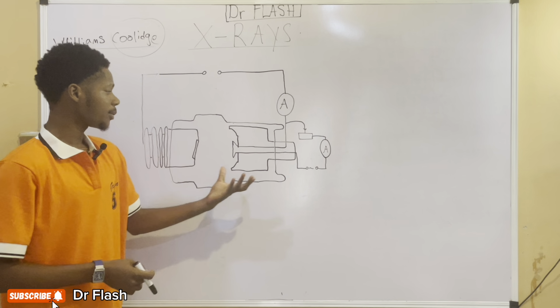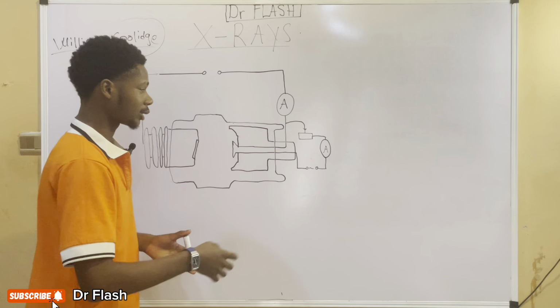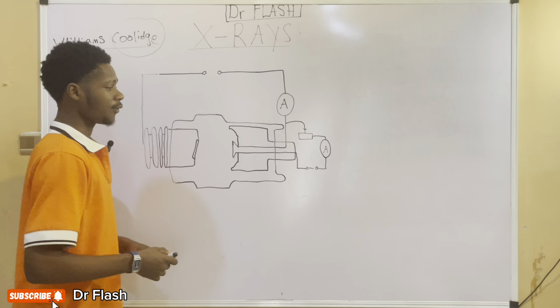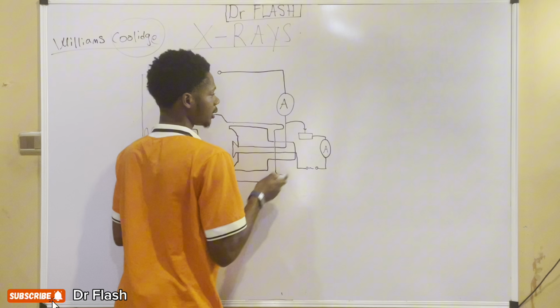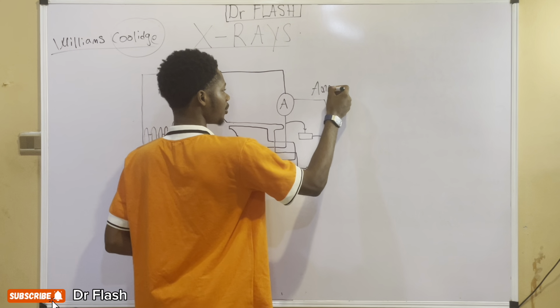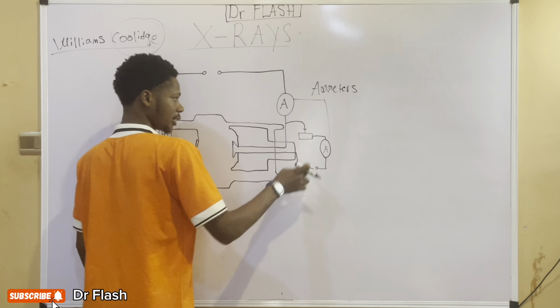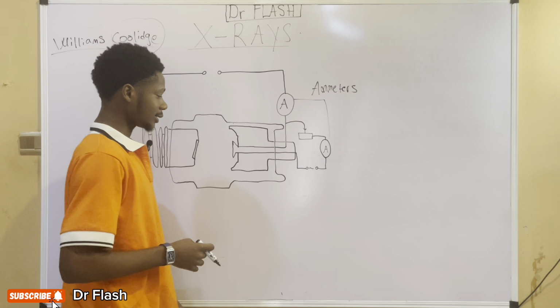Now, there are various unlabeled parts of this diagram which you are first going to label, and then we can talk about how each of these parts functions. These two parts represent ammeters for measuring the currents. This is a resistor, hence creating a rheostat on that part.